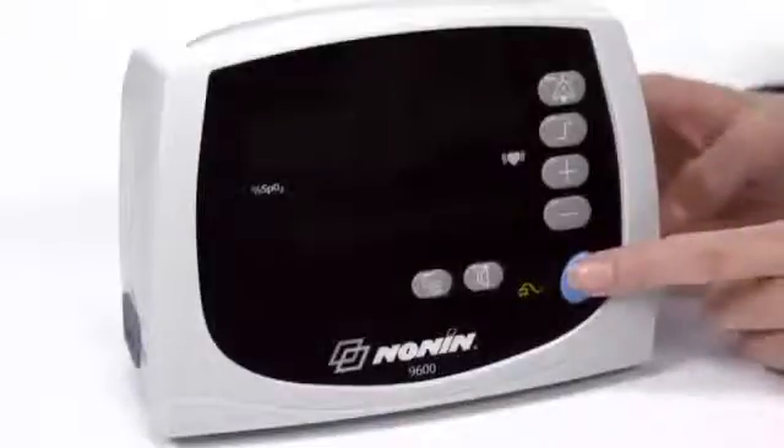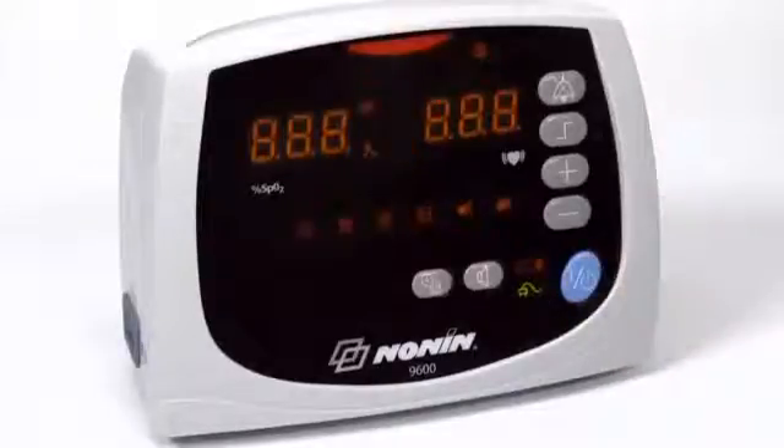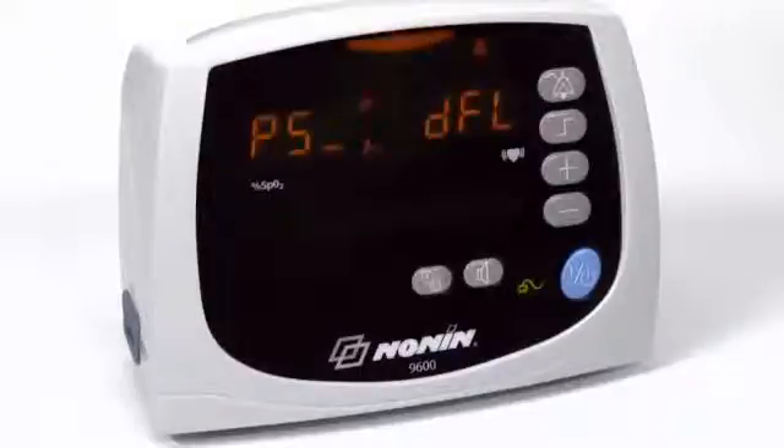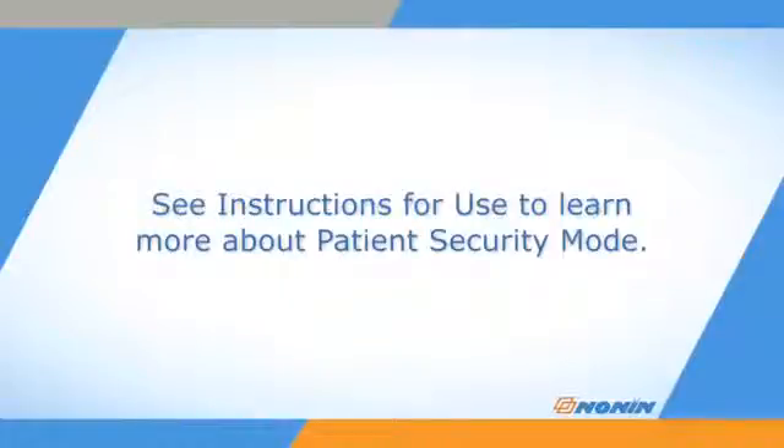A patient security mode prevents changes to alarm limits and a number of alarm and functional settings. During start-up you will see the software revision PS_DFL, meaning patient security mode is enabled, followed by the upper and lower alarm limits. Refer to the instructions for use to learn how to set or cancel patient security mode or reprogram settings.